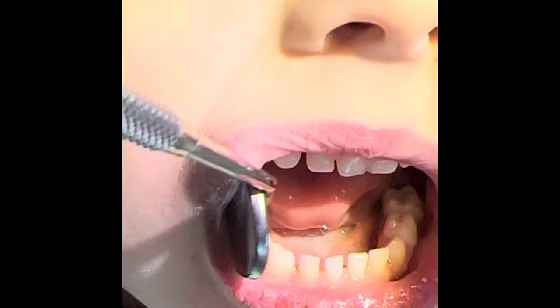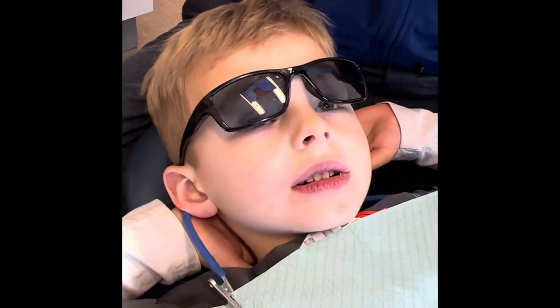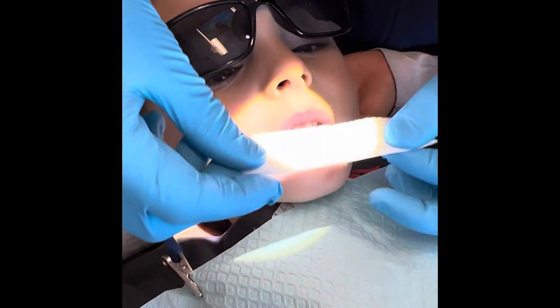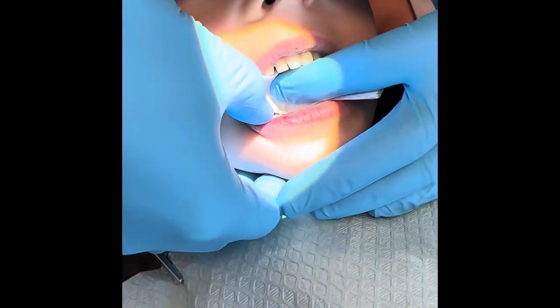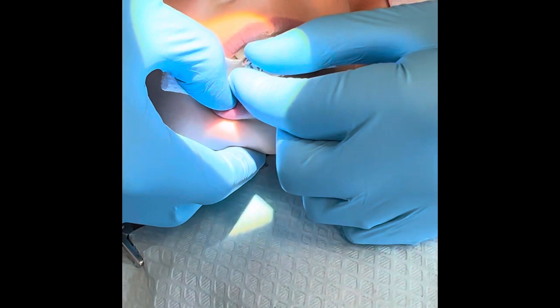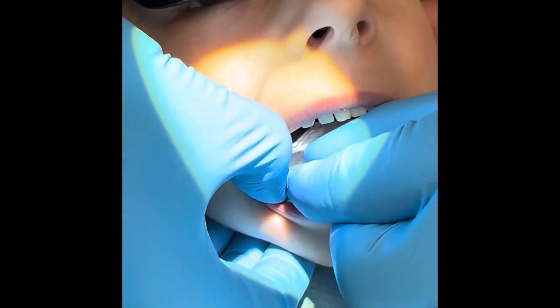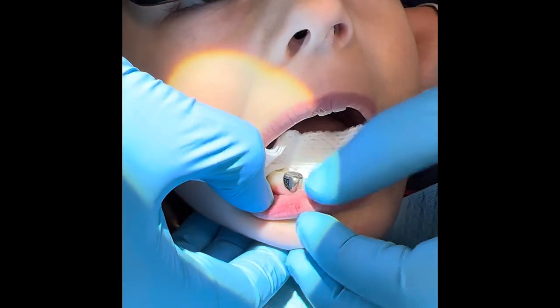And then we go ahead and we'll try on our silver crowns. I'm gonna use this little piece of cotton — I just go like this. Can you open really big, James? I'm gonna try in size five because James thought he was a five. Open big — just push — yeah, perfect!